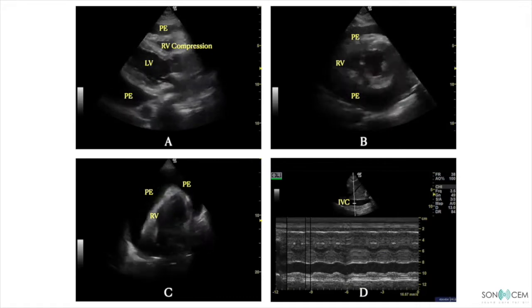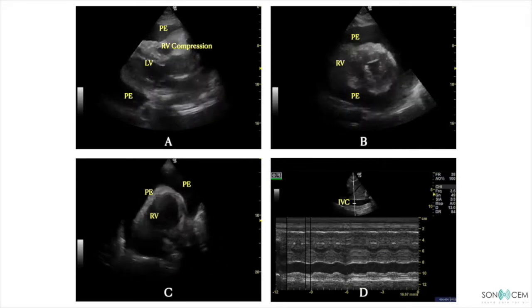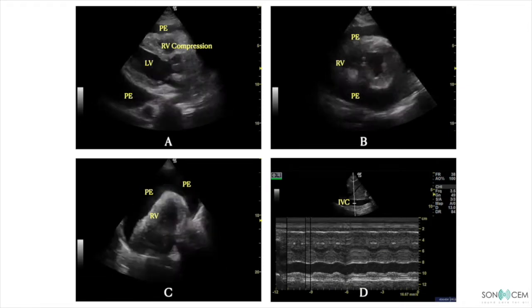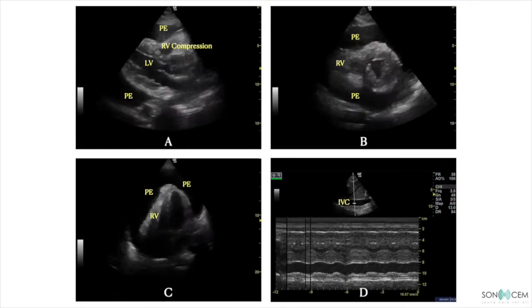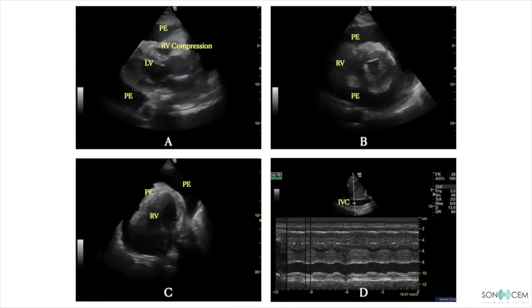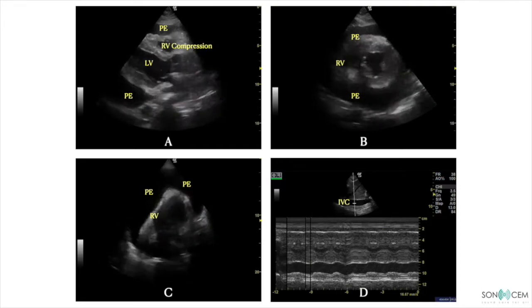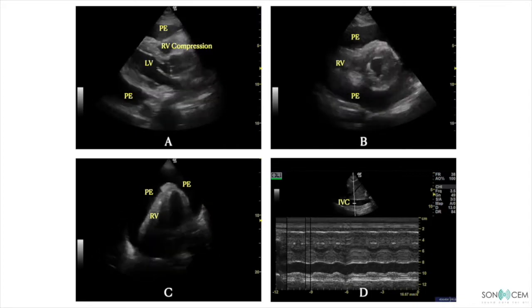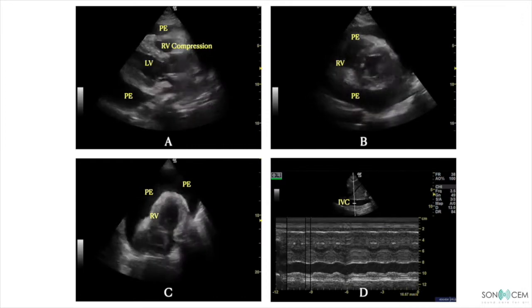This clip shows an example of cardiac tamponade. In clip A, which is the parasternal long axis, you can see pericardial effusion surrounding the heart. So this exerts pressure on the RV because the RV appears compressed. You can determine the phase of the cardiac cycle by looking at the mitral valve.